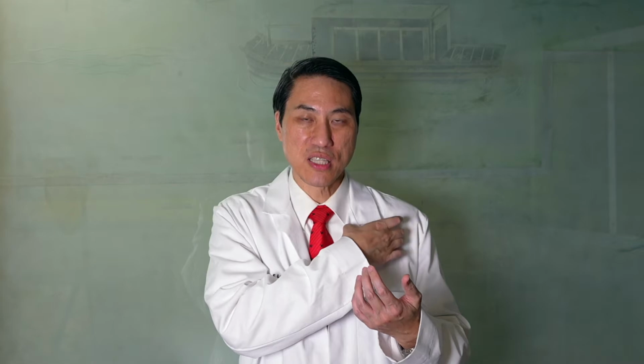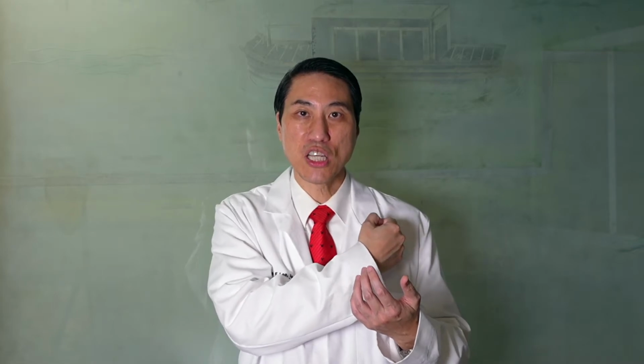actually have arm veins from both sides draining blood from our arms back to our heart. And so we can enter those veins right where the device is sitting, as the vein runs underneath your chest muscle, to enter those veins with the little spaghetti-like wires, and then follow those veins into your heart, and they touch different walls of your heart and they grow into place.